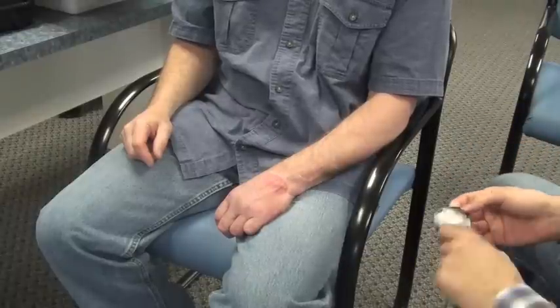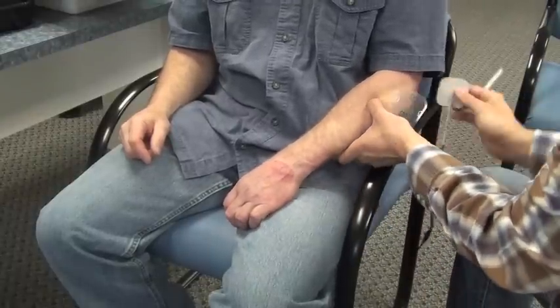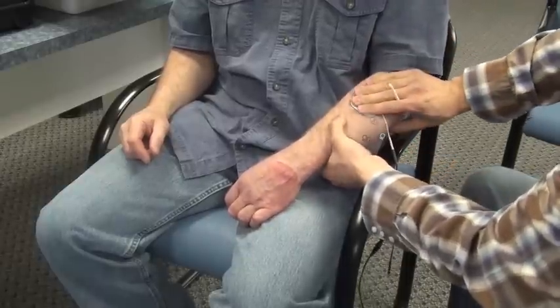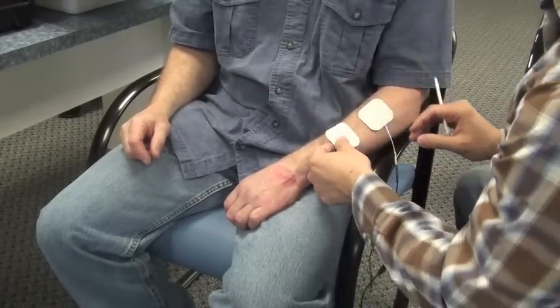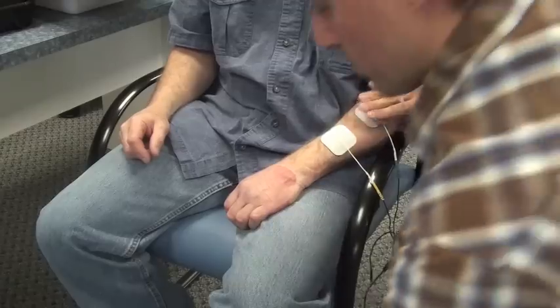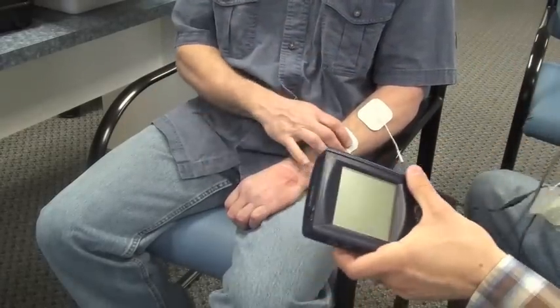The first thing you'll do is apply two stimulation electrodes to the affected wrist and finger extensors. As a reminder, with reciprocal EMG-triggered stimulation, channel A is responsible for the stimulation and channel B is responsible for biofeedback. You'll identify the location for the wrist and finger extensors and apply the adhesive electrodes.